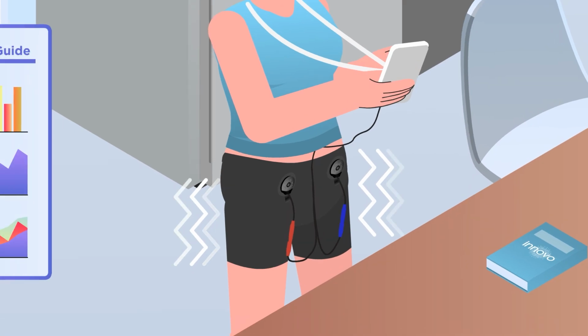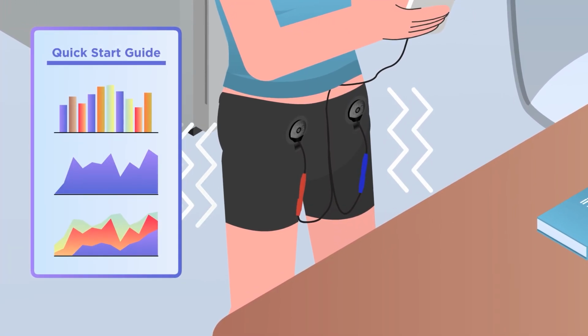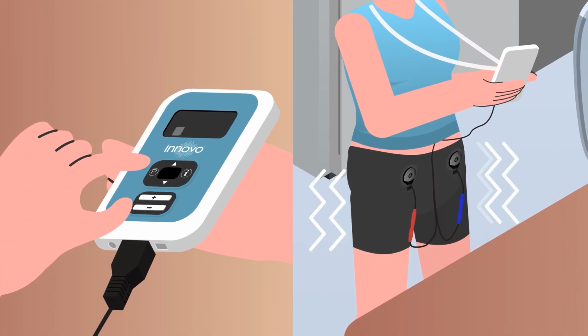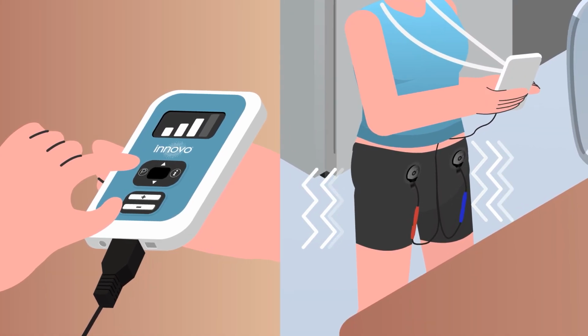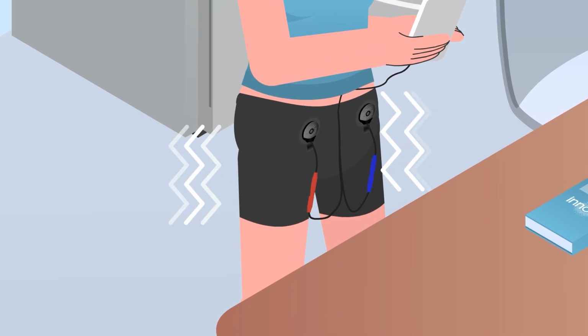Refer to the size and intensity chart in the Quick Start Guide to know which level of intensity to select. As you increase the intensity on the controller, you will start to feel your pelvic floor contracting. With an effective pelvic floor contraction, you will feel a sensation of squeezing, lifting up between your legs.